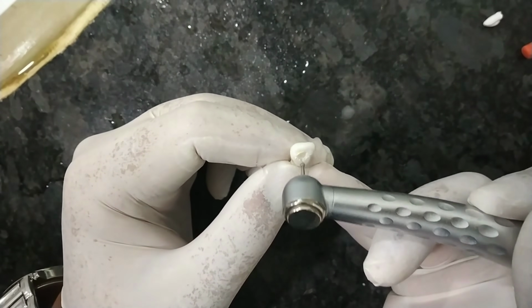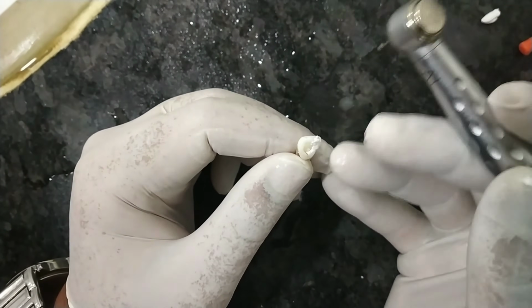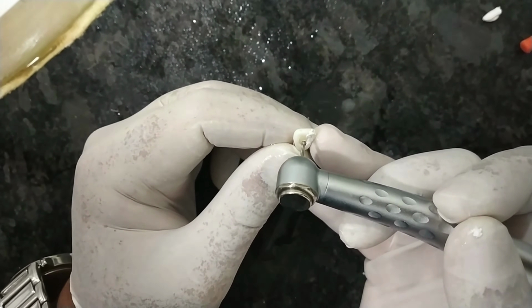Now I made this punch hole. I have already done the access opening. Now what we have to do is remove the excessive dentine which is present in and around the tooth.